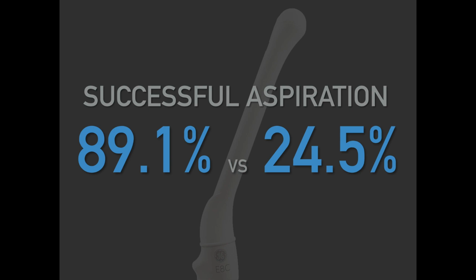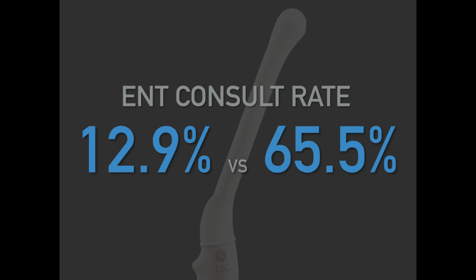But in this case, the data suggests that ultrasound basically makes you more successful at aspirating a peritonsillar abscess if it's there. It also still persistently means you don't talk to ENT as much, which I think probably is good for them. They don't need to be woken up for every peritonsillar abscess, I don't think. I think that's something that's well within our wheelhouse. We should be able to handle it without involving them most of the time. Sometimes we need to, but most of the time we don't.